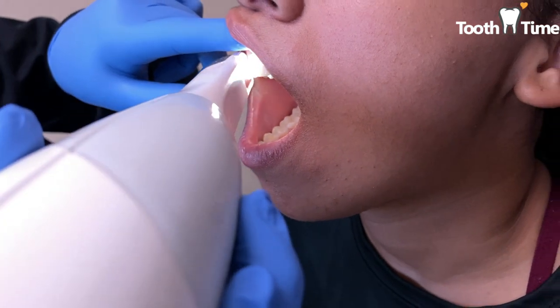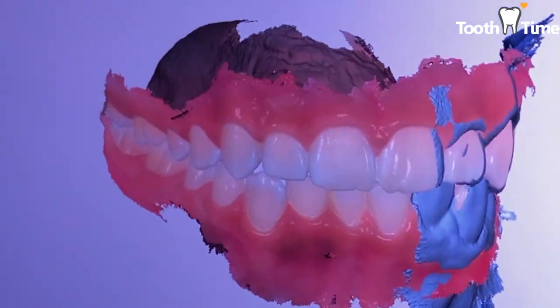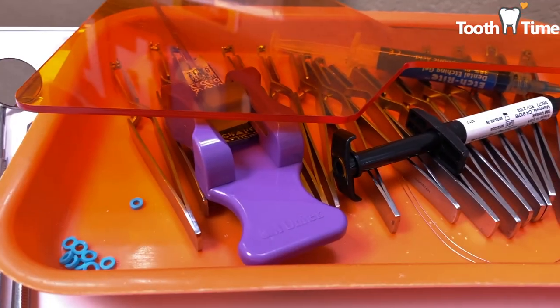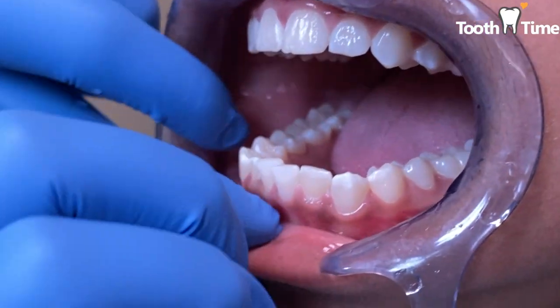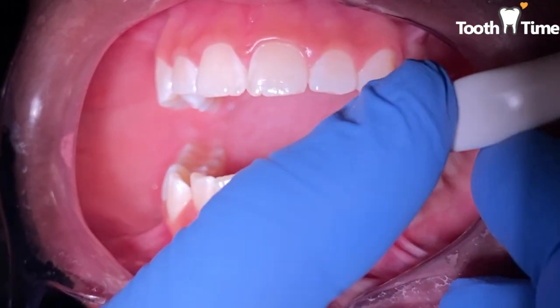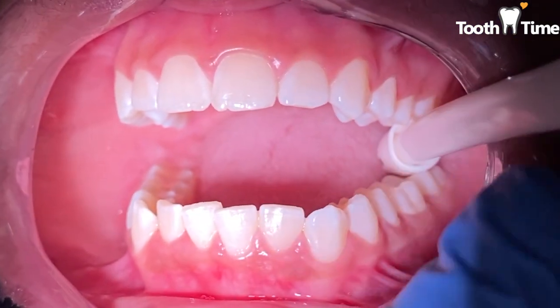In today's video we're gonna show you a patient who's gonna get her braces put on. She is 13 years old and she presents with some mild to moderate crowding. On top, just some mild maxillary crowding — maxillary means the top — and then the bottom is the mandibular, which has moderate crowding. The mandibular is the lower.